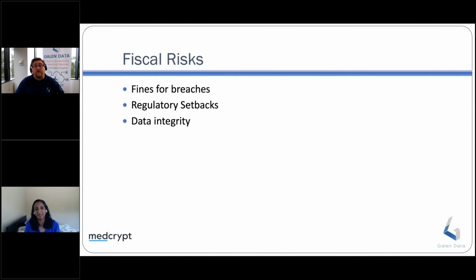It's not uncommon now. What I've heard is anywhere from 6 months to a year in delay of getting your device approved because these companies didn't do everything that they're really looking for around documenting these things, documenting security, documenting threat modeling, all of that stuff. Even though this is a guidance, I still feel they're already looking that way to make sure people are doing it.